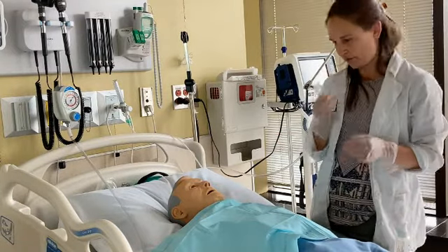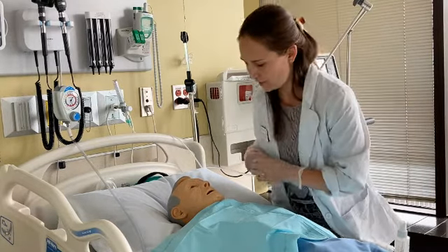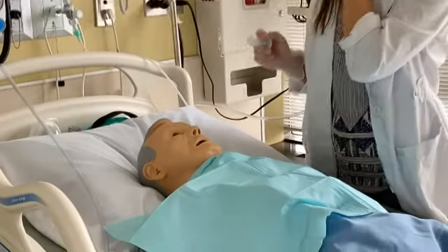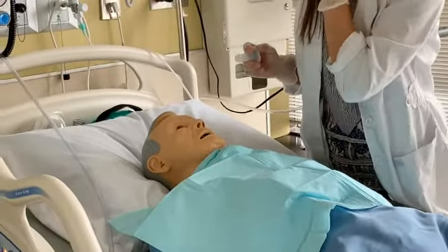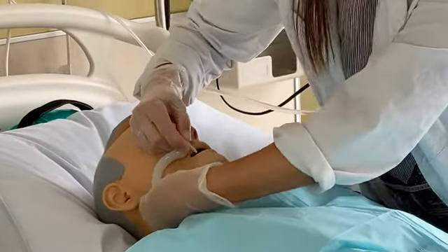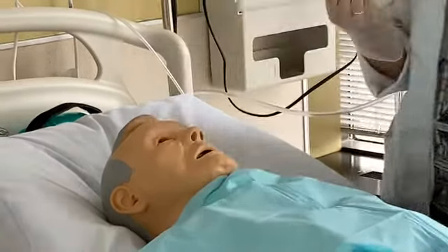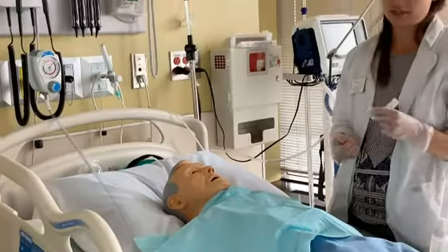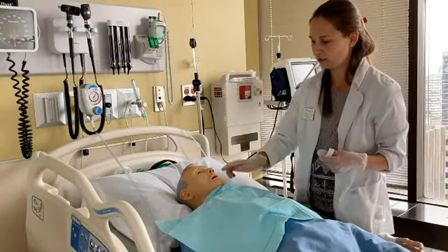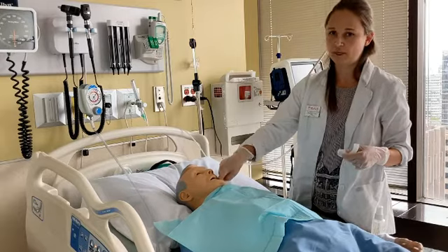What I'm going to do is I'm going to take this airway and I will measure it first. For oropharyngeal airways, we measure from the tip of the lips to the angle of the jaw, which is the bone that is here, the protrusion of the bone. So I'm going to put it to the tip of the lips, to the angle of the jaw, and this seems to be the right size for my patient. What I'm going to do next is I'm going to double check that the patient doesn't have a gag reflex. So what I can do is I can take a tongue depressor and gently stimulate the top of the patient's mouth to make sure that the patient does not gag.